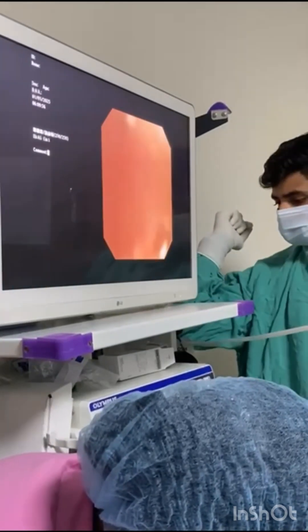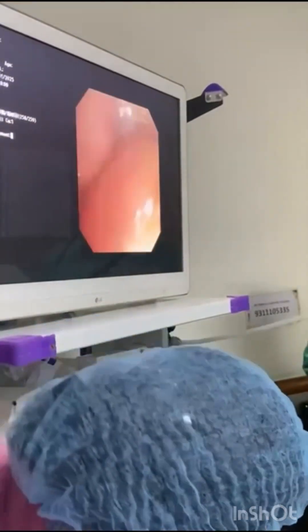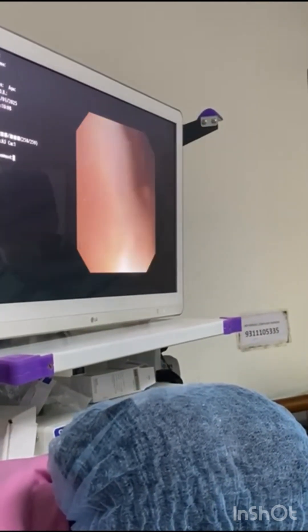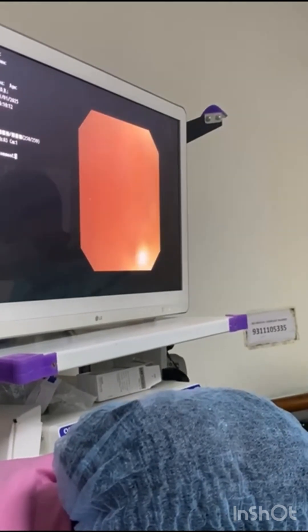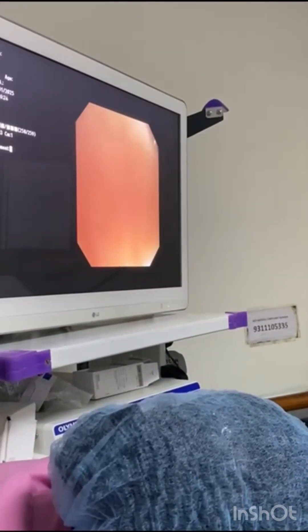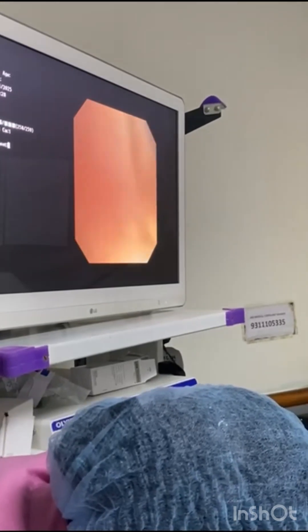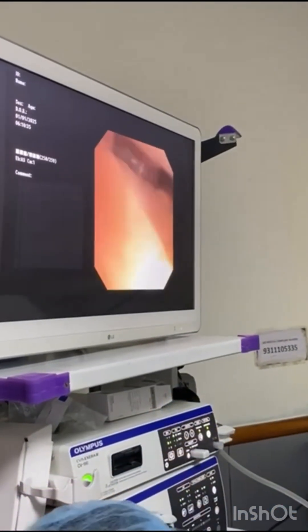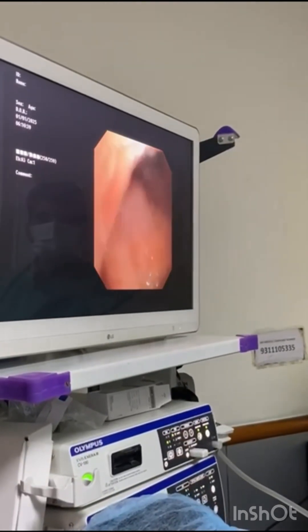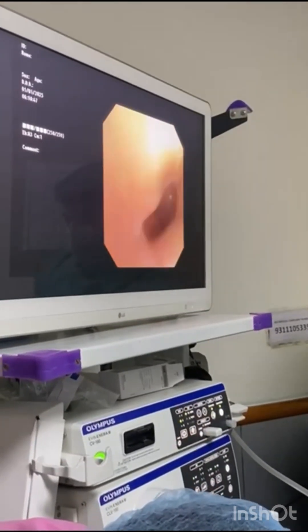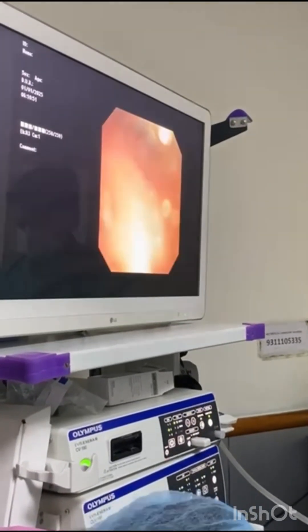This is the larynx, also called the voice box. Nothing is visible now, so I am retracting the scope a little bit and then looking for the larynx again. Now yes — it is coming into the picture. This is the epiglottis, a white structure, but it is omega-shaped. It should not be omega-shaped normally. It is covering the glottis, responsible for the noisy breathing and the stridor. The diagnosis is now clear.